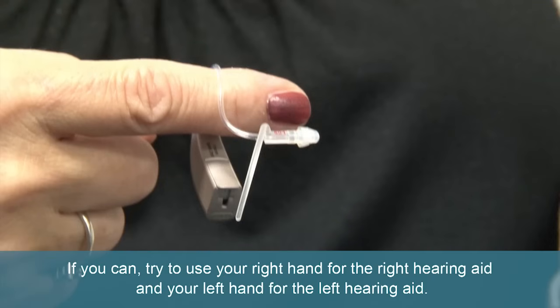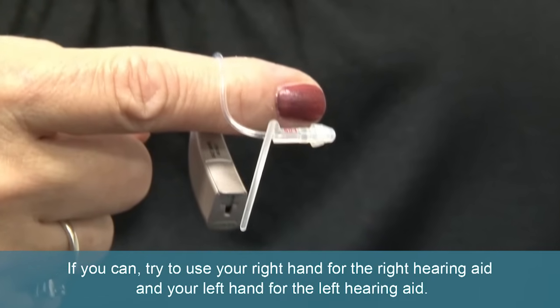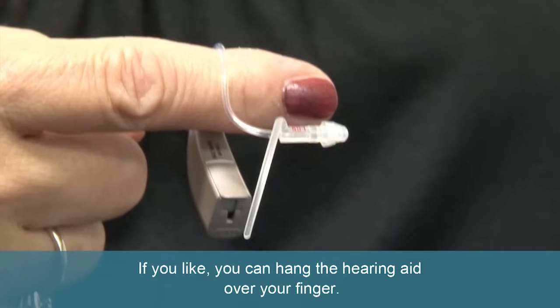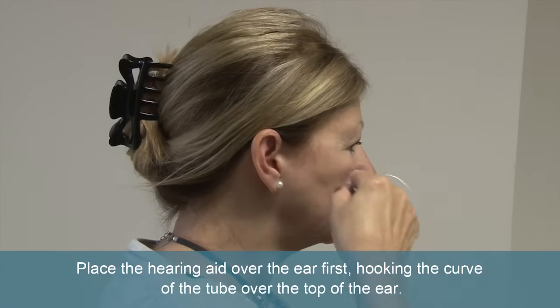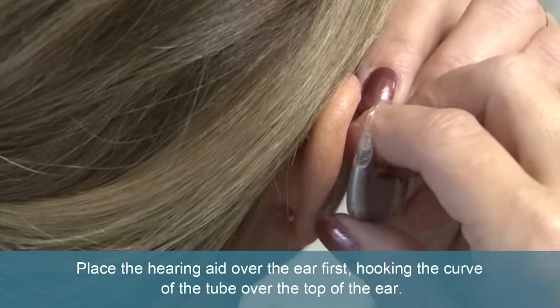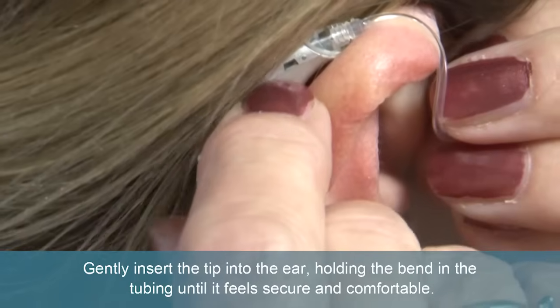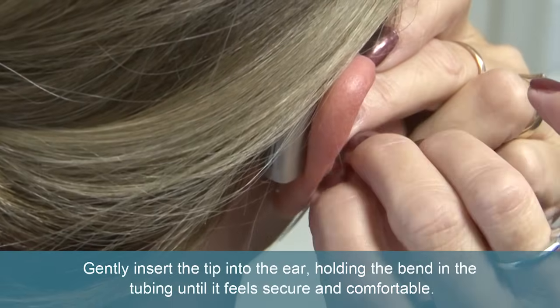If you can, try to use your right hand for the right hearing aid and your left hand for the left hearing aid. If you like, you can hang the hearing aid over your finger. The tip of the tube where the sound comes out should be facing towards the ear. Place the hearing aid over the ear first, hooking the curve of the tube over the top of the ear. Gently insert the tip into the ear, holding the bend in the tubing until it feels secure and comfortable.